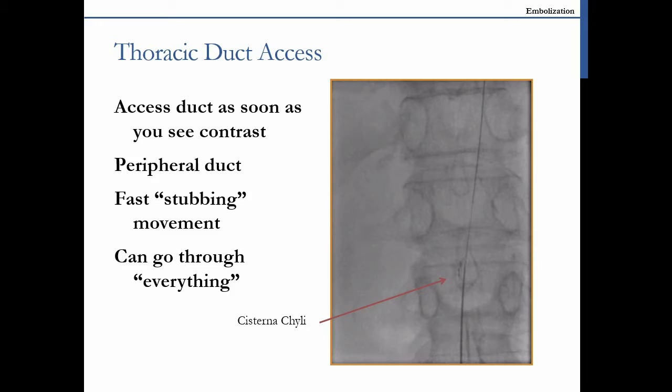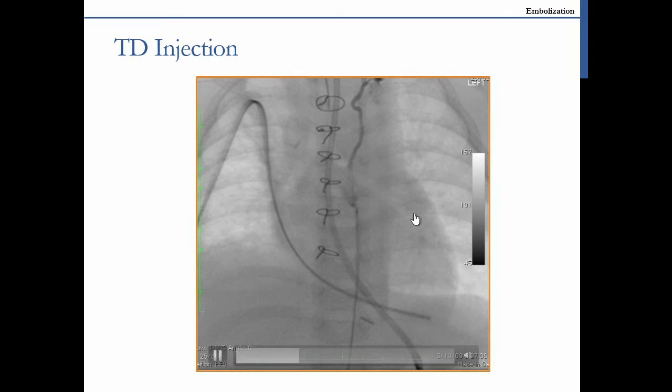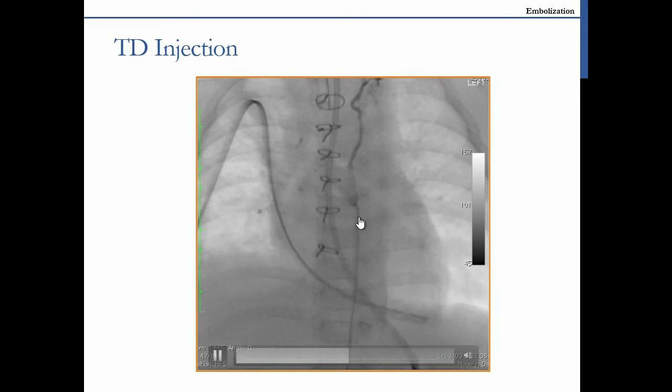Put the needle and put the wire inside. It's absolutely safe. I did almost 450 cases right now. We practically don't have a complication. Only in the small children, newborns or premature, they can get sick from the procedure for 1 or 2 days. So you saw here the wire goes inside the thoracic duct. This is a catheter inside the thoracic duct.